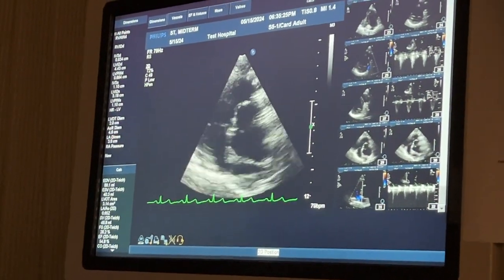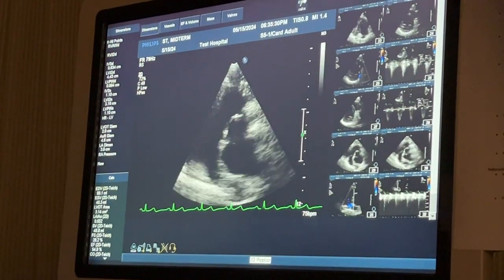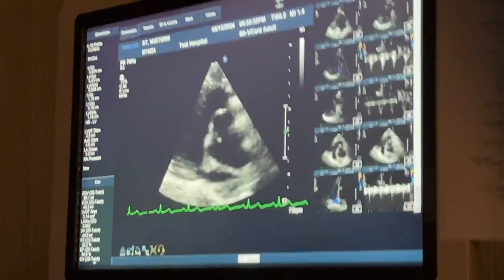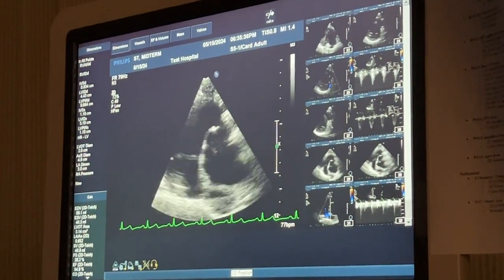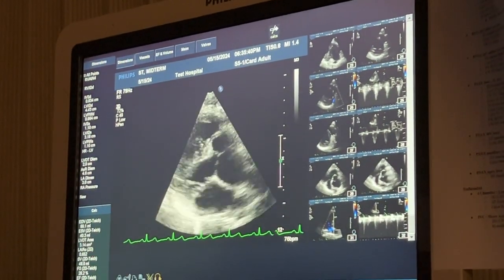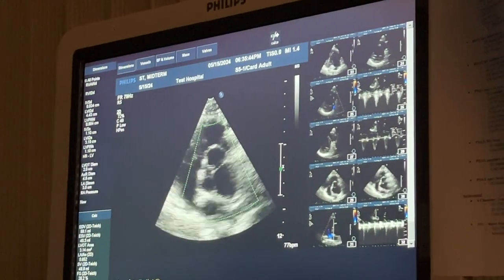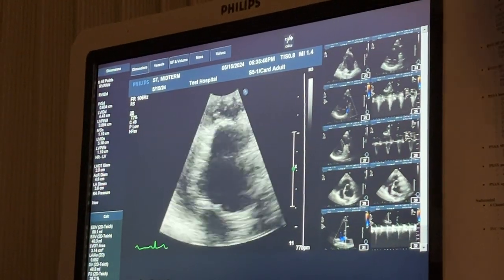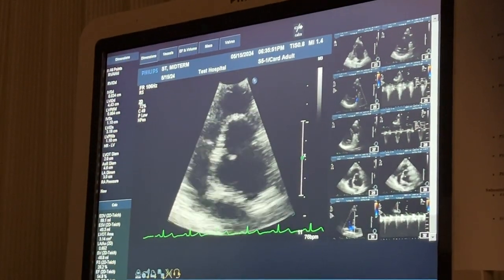I'm going to round out my aorta and try to see all of the leaflets. Did I have you guys zoom? I don't think I did. Oh, yeah, this is what I said. Okay, it wasn't zooming in parasternal long axis, it was zooming in parasternal short axis that I said we don't do, but I'm going to do it here because we have a cool valve replacement to look at. So see all three of the leaflets.